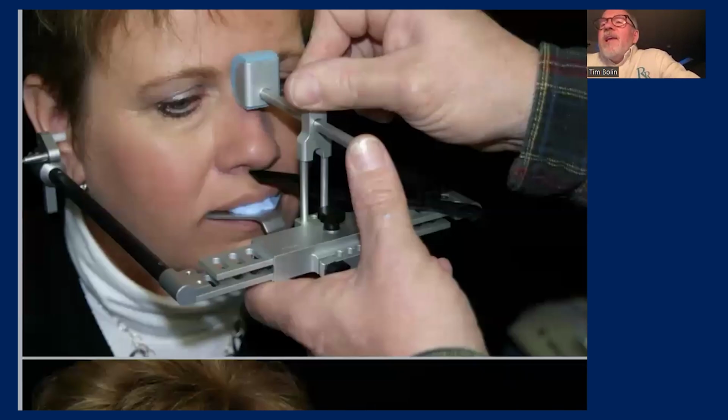Here I did use the Nasion piece on this particular case. I did use the Nasion piece there. And I've got the pointer directly at there.